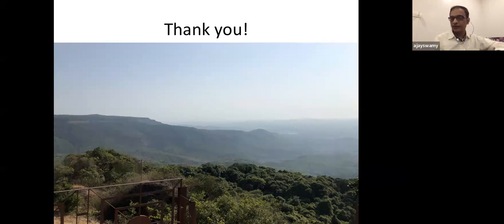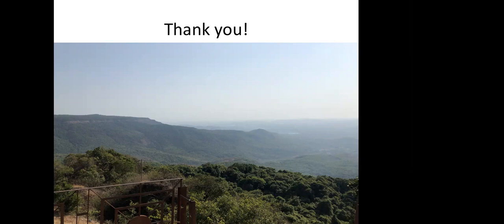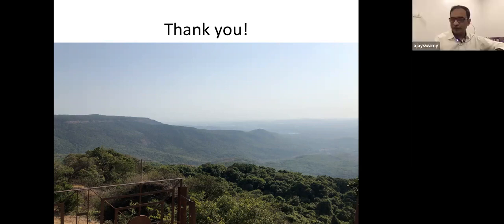I have speeded up the videos which I have shown here, just to try and have a little more discussion. Okay, sir. But I suppose it looked extremely fast. We're not usually that quick, and that is only done in case you're really scared of the burr getting entrapped. Okay, thank you, sir.